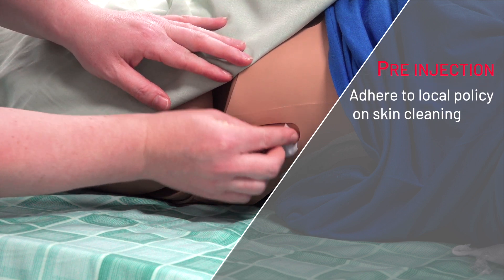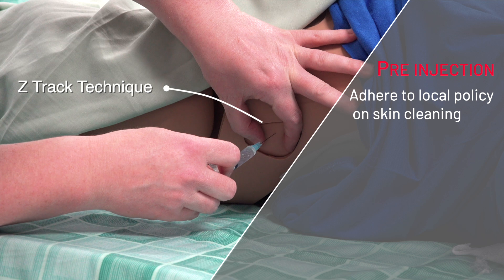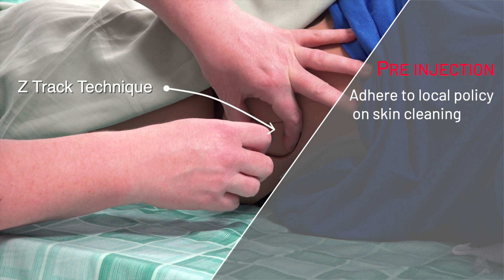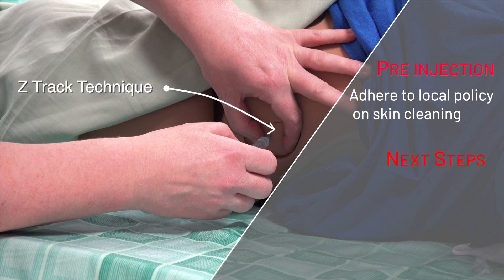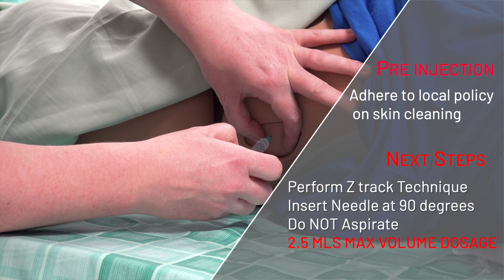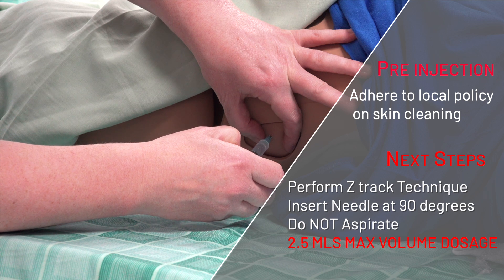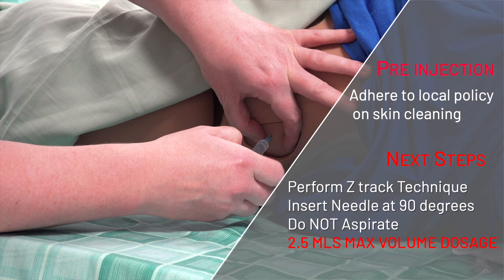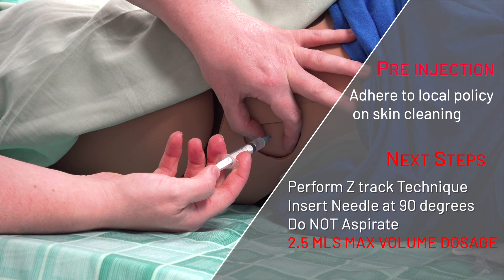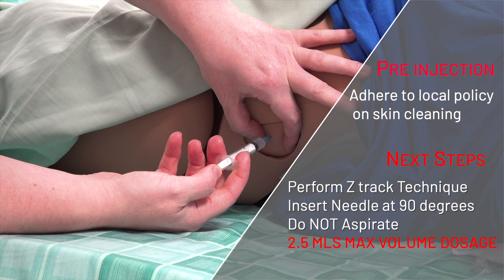Hold the syringe in your dominant hand. Use the Z-track technique: stretch the skin two to three centimeters using your non-dominant hand. Insert the needle at a 90-degree angle with a dart-like motion. Inject slowly — one milliliter per 10 seconds.